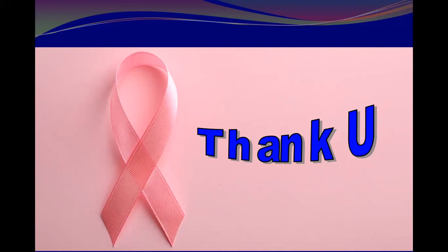No, it has no shape. It is not a mass. It will not be three dimensional, because it is not a mass. But if you see parenchyma like this coming anterior with these criteria, that means you are dealing with a parenchymal or fibrous ridge. But in the region of the areola, again, think about Montgomery. Okay, think about Montgomery. Okay, thank you.